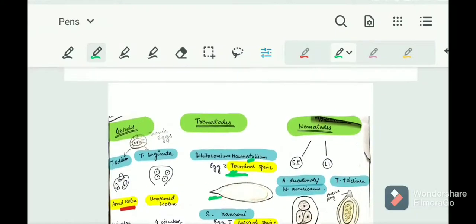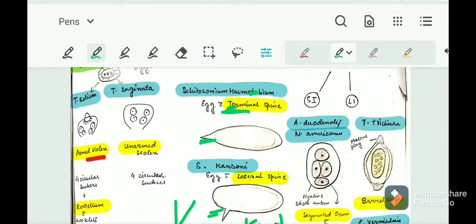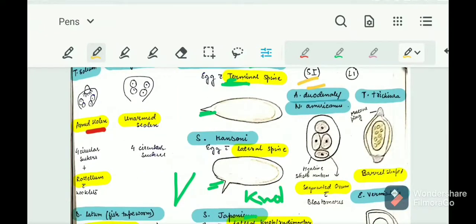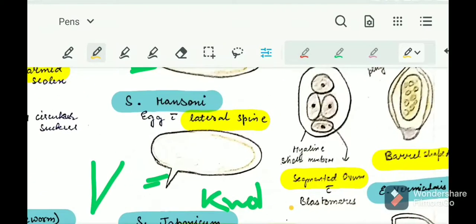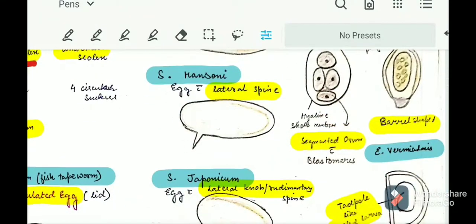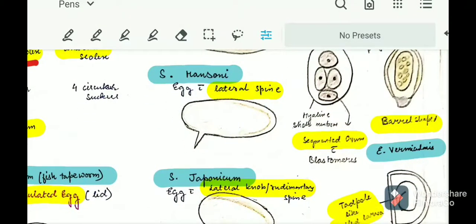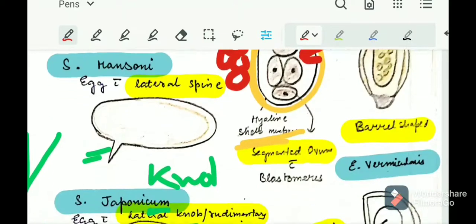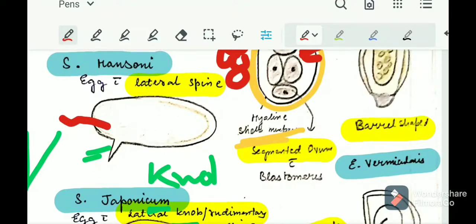For nematodes, we can differentiate by location — small intestine nematodes versus large intestine nematodes. Small intestine nematodes include Ancylostoma duodenale and Necator americanus. Both eggs look similar: they appear as a hyaline membrane shell with a segmented ovum inside containing blastomeres. The segmented ovum with four blastomeres is the key feature.